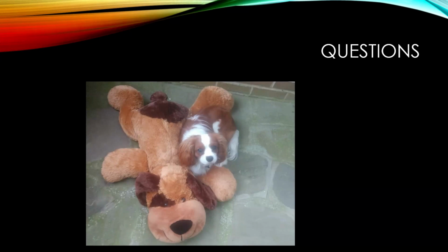But like I said, in this case, because I knew what this tumor was, and I knew that similar tumors have been really, really superficial, I was pretty confident that the bone was going to be enough of a margin, because it was so superficial. And then just making sure that we got the entire alveolus, all the tooth roots and everything.